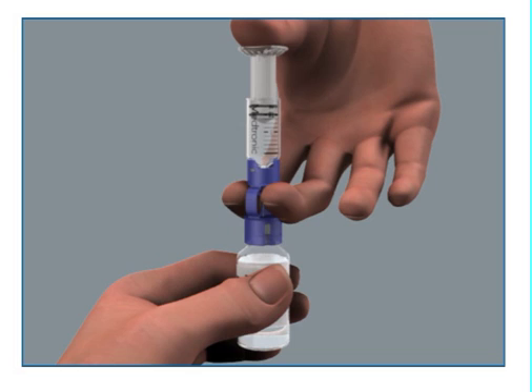It is important to put air into the vial before taking insulin out. With the insulin vial upright, place your thumb on the plunger and firmly push the air from the reservoir into the insulin vial.